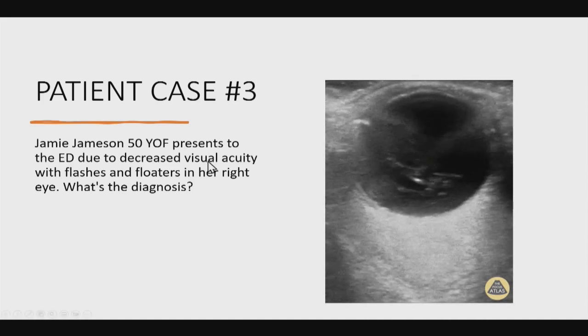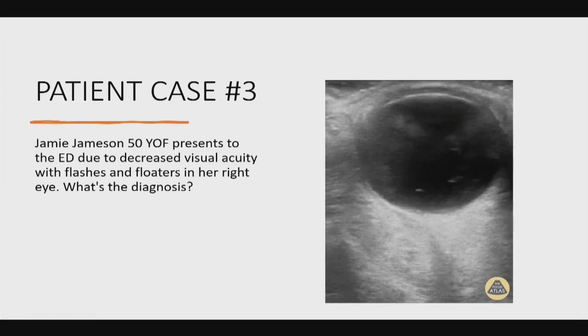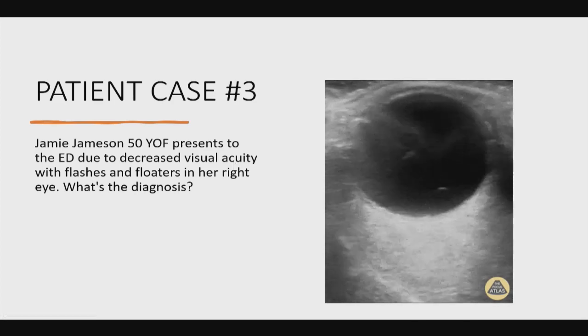And now we have Miss JJ who comes in. She's telling you that she's seeing weird stuff in her visual fields. So you throw the ultrasound probe. What do you guys see?